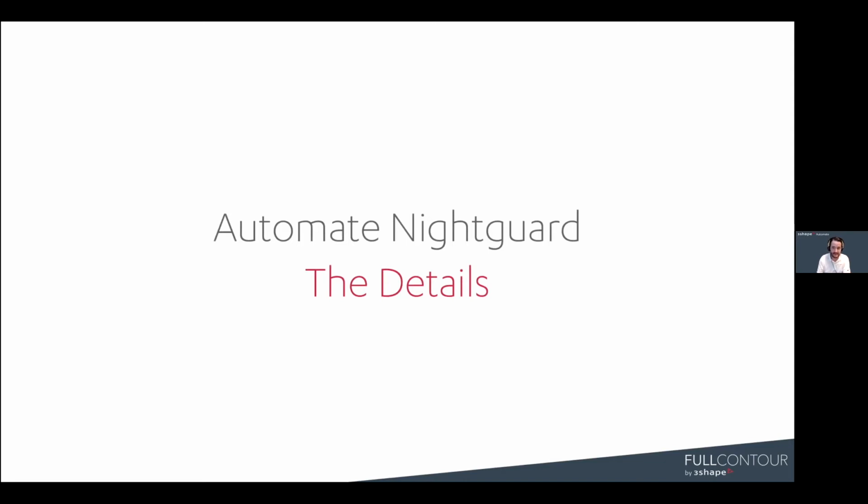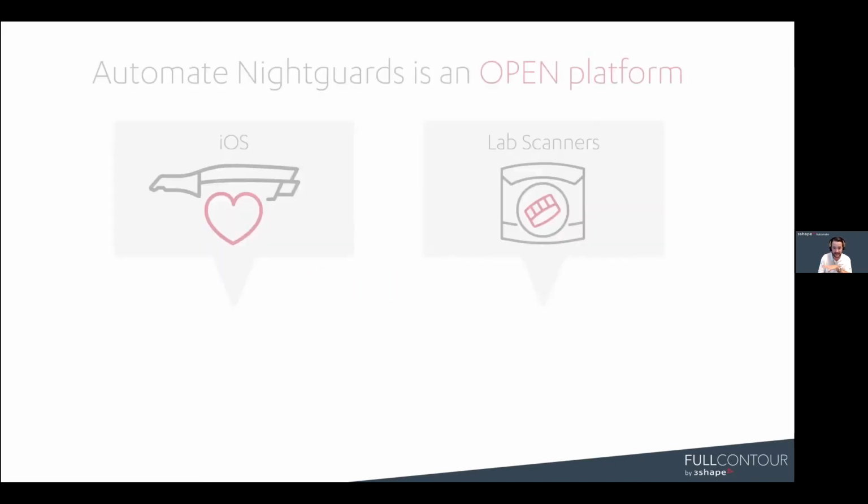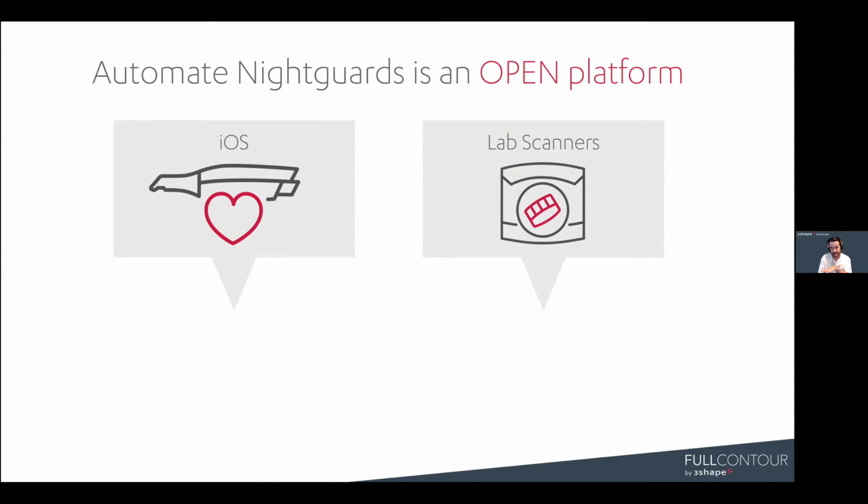We're going to get into some details now and dive into Automate Nightguard. For those of you who have already tried it, you might have some good questions, and I hope I can answer some of those questions here as we dive into the details. So first thing is Automate Nightguards is an open platform.